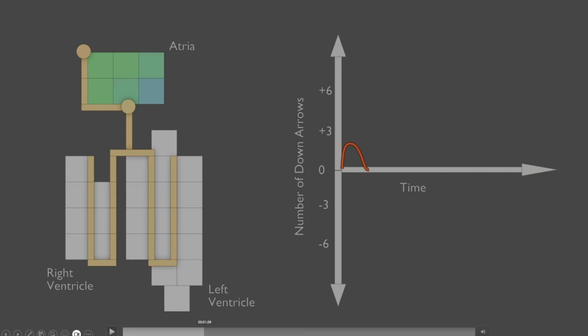What happens next in the process? All of our atrial cells are green or almost green. There's no movement happening. So we get a period of nothing. We get a flat line on our tracing while that impulse is held up in the AV node. So this flat area on the EKG tracing after the immediate atrial depolarization reflects the pause that occurs within the AV node.